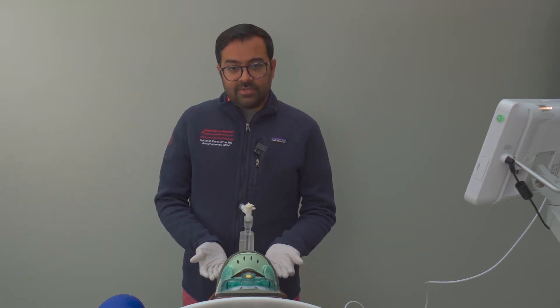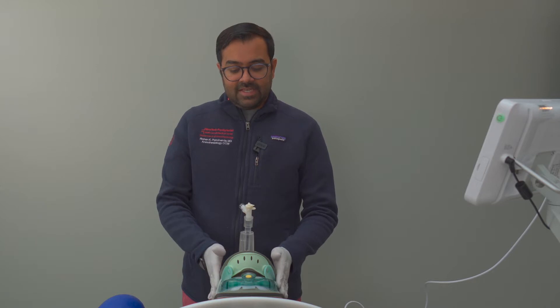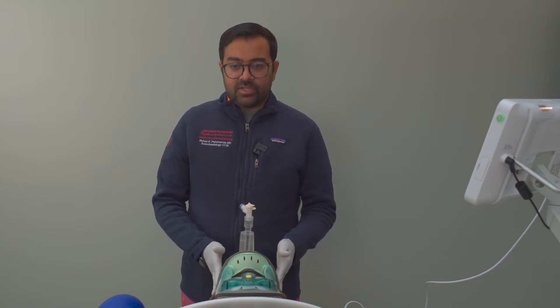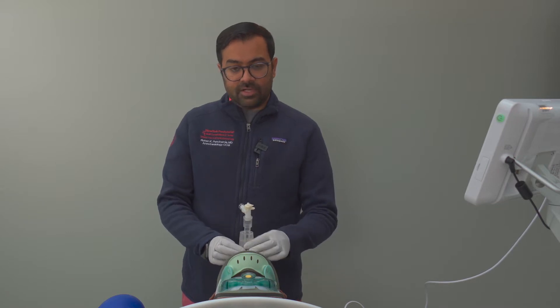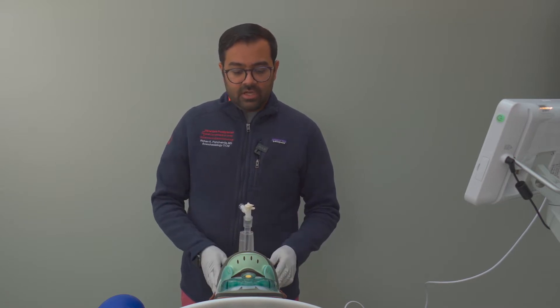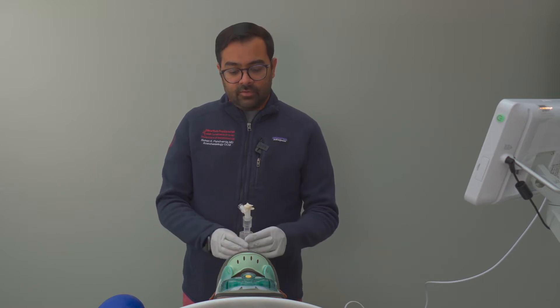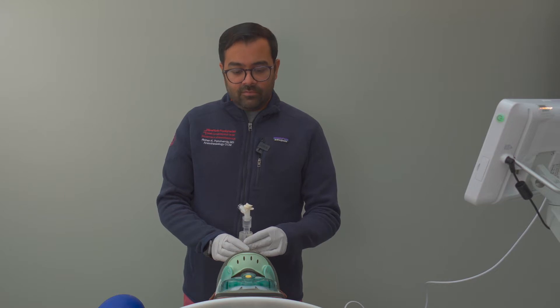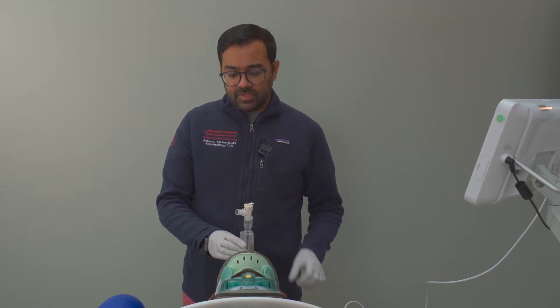In front of us we have a trauma patient who has a suspected cervical spine injury, and for that reason has a C-collar in place. Unfortunately, this patient's neurological exam deteriorated and the patient needed to be intubated. After a few attempts at intubation, a rescue airway in the form of a supraglottic airway — in this case the iGel — was placed to ensure oxygenation and ventilation. However, we know that the supraglottic airway is not a protected airway, so for that reason we will need to exchange this iGel out for an endotracheal tube. Let me walk you through it.